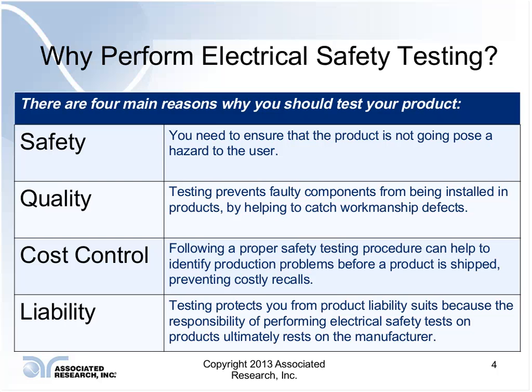Obviously, if you put the product through its testing paces, you go through a testing lab, maybe you have a testing lab in-house, that goes a long way to making sure a product's safe. But that's the prototyping or the design phase. There's always possibilities that on the production floor something happens.